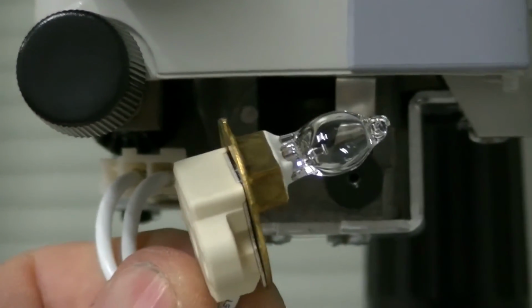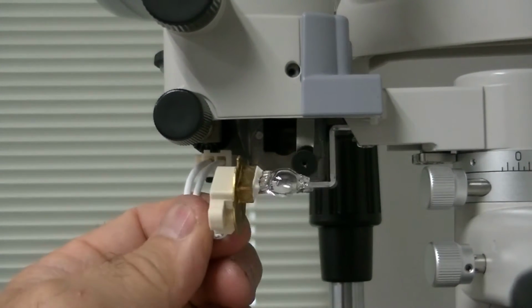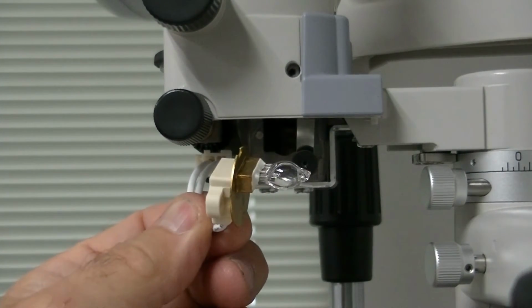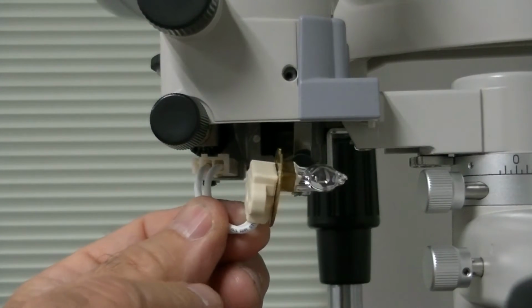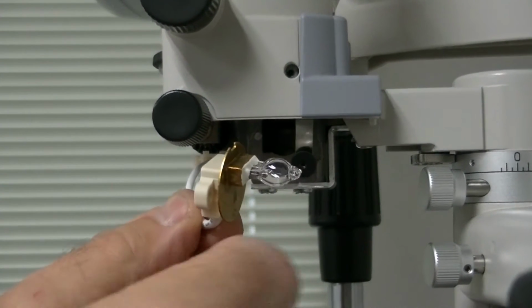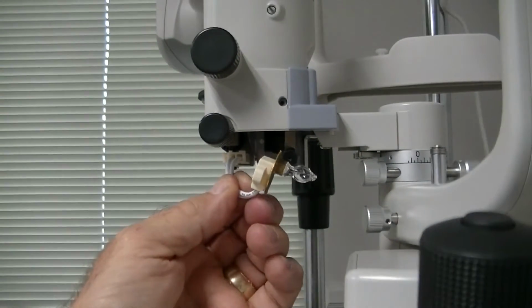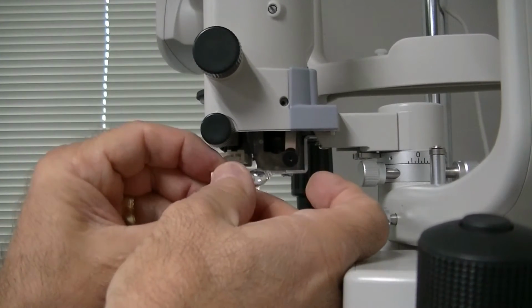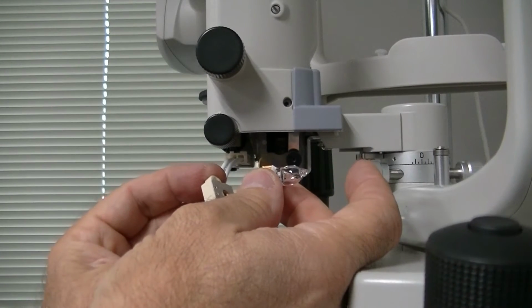like this. Now, you might think that that bulb and this whole piece is one assembly, but it's not. It's two different things. This bulb will separate from this lamp piece. And how you do that is you hold the lamp piece, let me zoom out a little bit so you can see it. Hold the lamp socket in one hand and pull apart. And as you can see, they will separate out.